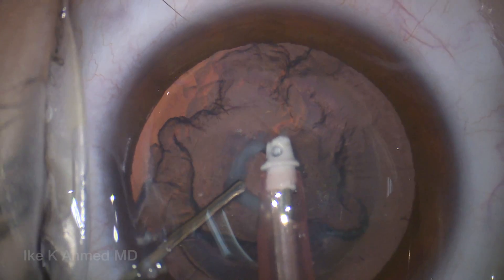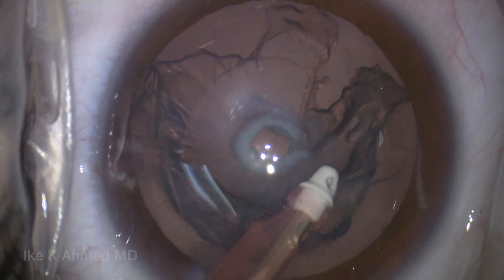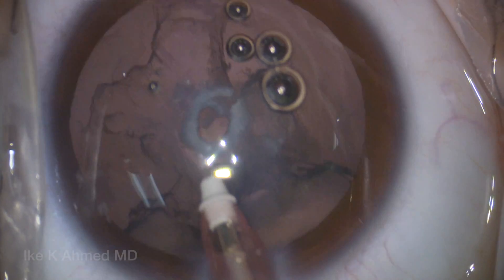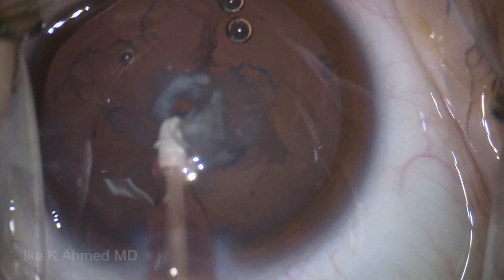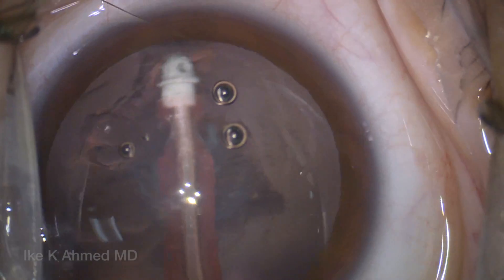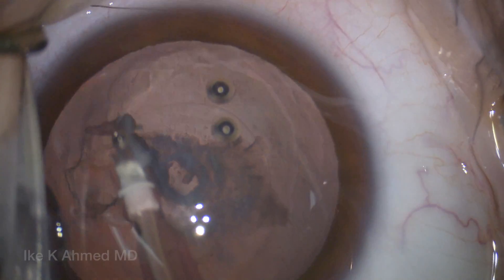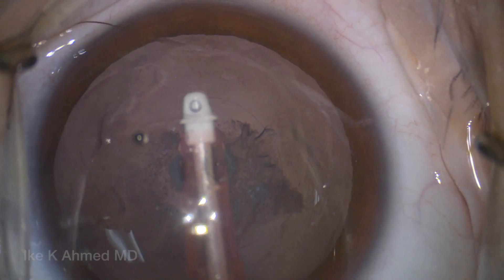We're going to re-inject some dispersive viscoelastic here. We do have concerns centrally that we perhaps have a deficient posterior capsule. Certainly the anterior hyaloid dots likely increase the likelihood of that being the case. We continue along with the epinucleus removal, and at the end we remove the central posterior opacity. In this case we really have a high suspicion that the posterior capsule is deficient — you can see some of that material sitting behind that opening, which increases our suspicion.